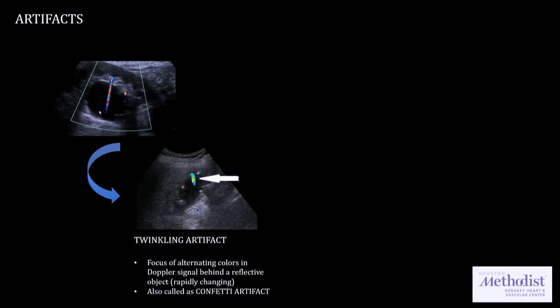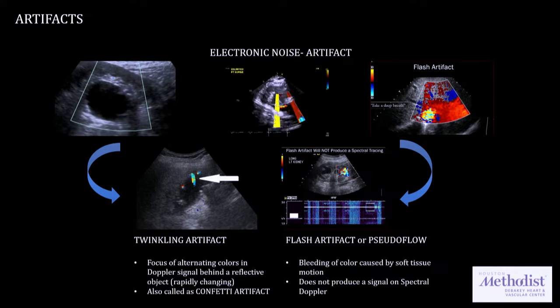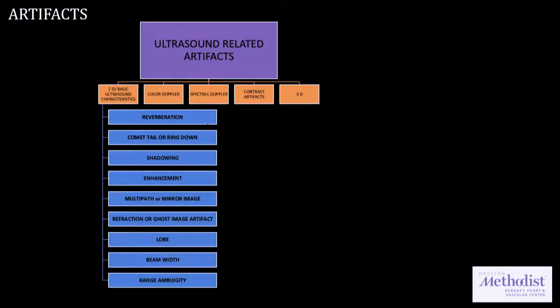This one here is a twinkling artifact. And this one here is actually a flash artifact. It's actually a pseudo flow. It almost looks like there's a false flow. And this one here, we see quite often too, is when we have electronic noise from devices. When we have Impella and all that, sometimes you can see that.